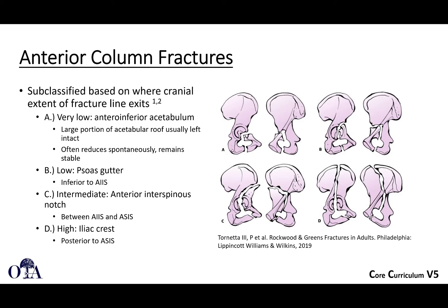Anterior column fractures are the next elementary type. These are subclassified because there's a lot of real estate with anterior column fractures — they include the whole anterior part of the iliac wing, and fractures will commonly exit up there. You have low anterior column fractures and fractures that work their way higher and higher up the iliac wing. So there are very low ones, low ones, intermediate, and then way up the iliac crest, as shown in these images.